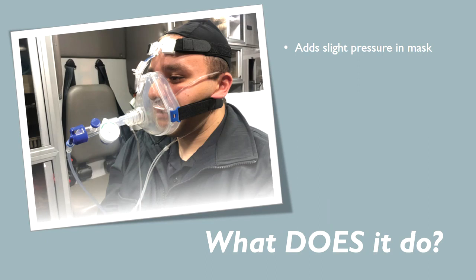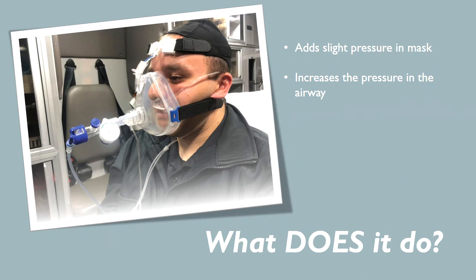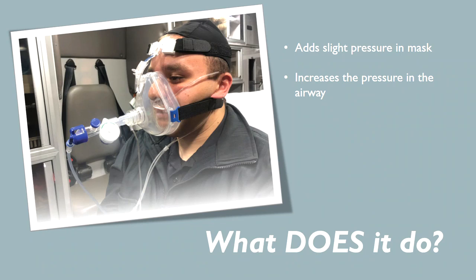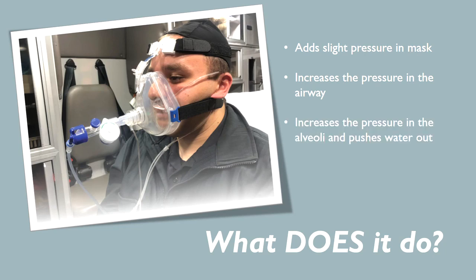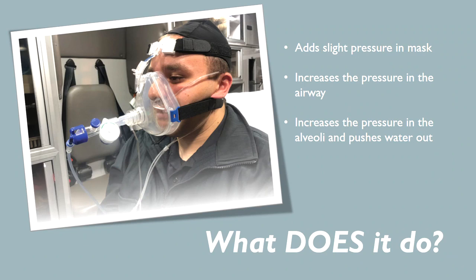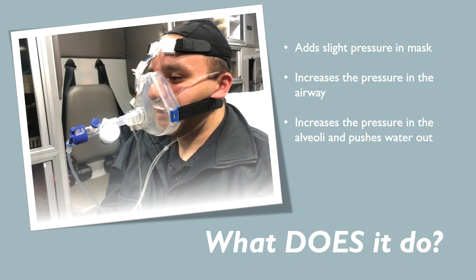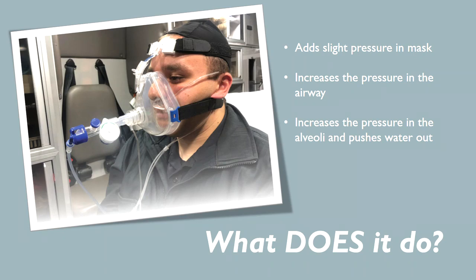When we put a little pressure in that mask, it changes the atmospheric pressure for that patient, and it changes the way our body balances the air pressure in our lungs. It's a simple concept. When we increase the pressure outside our patient's airway, that pressure balances — it therefore increases the pressure in the airway. That increased pressure goes down the trachea, down the bronchial tubes, and moves into the alveoli. So if those alveoli are collapsed and closed, it sort of pops them open. If they have water in them, it will push that water out because there's more pressure in the alveoli than there is outside — so we have that fluid shift.